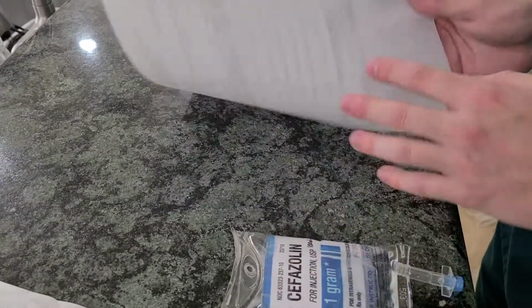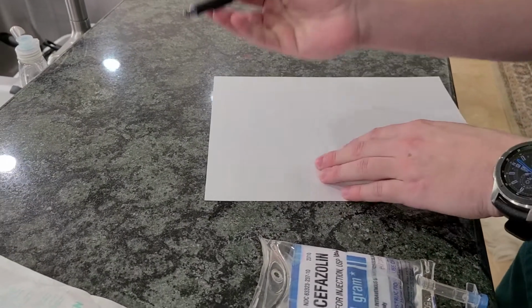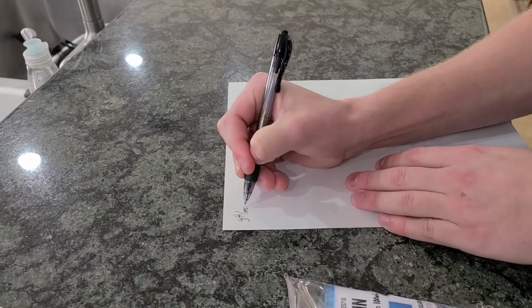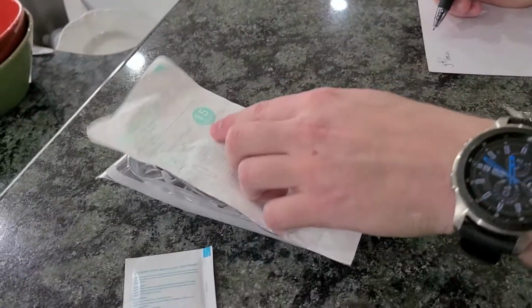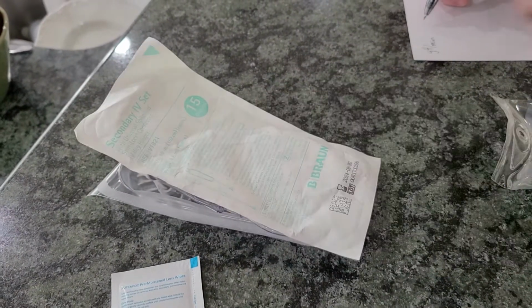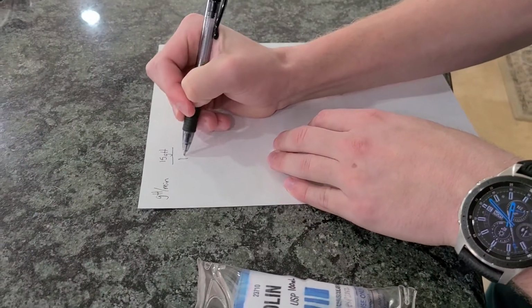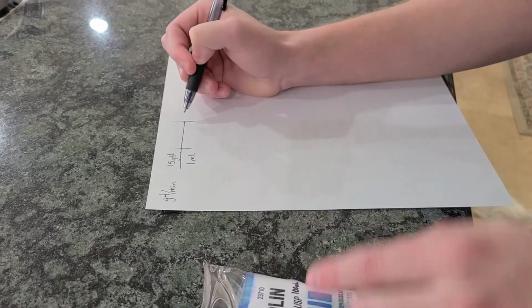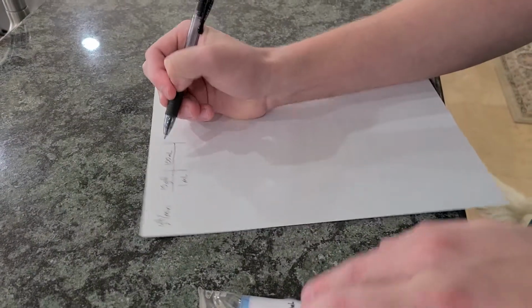Now I'm going to do my medication math. We need drops per minute. The IV tubing set is 15 drops per 1 mL. We're giving the bag of cefazolin, 100 milliliters, over 30 minutes.